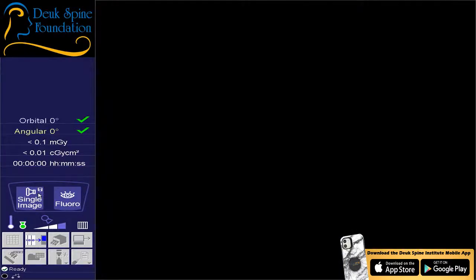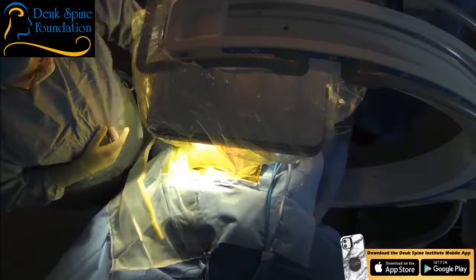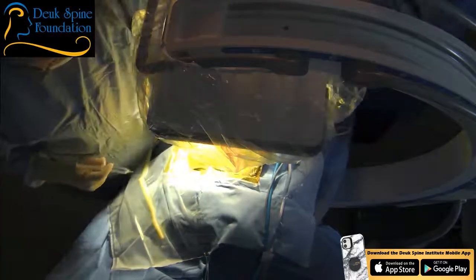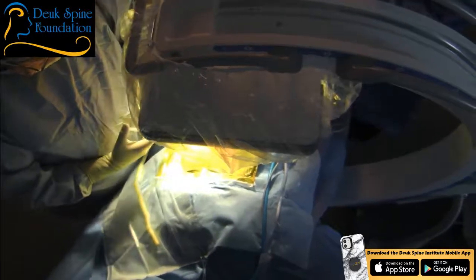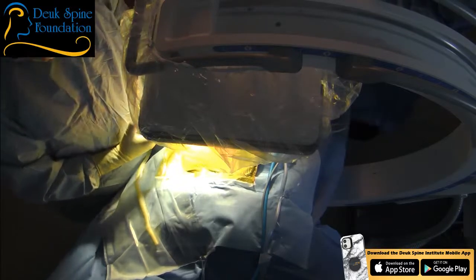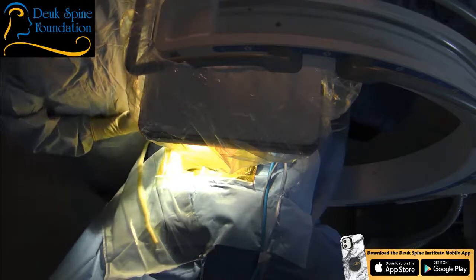All right, right now I'm just feeling around. I'm feeling my landmarks on the spine. I'm feeling the iliac crest. Our patient is pretty debilitated with pain. You're going to feel a little stick and burn, okay? All right. Now, I can't tell you exactly where we need to go in because it's very hard to do that. You can't look at somebody's back and see where the discs are.